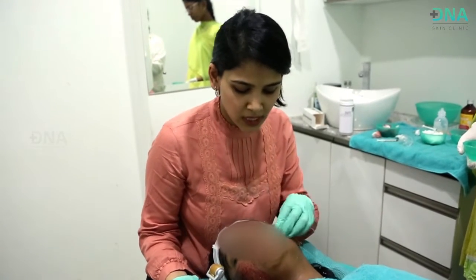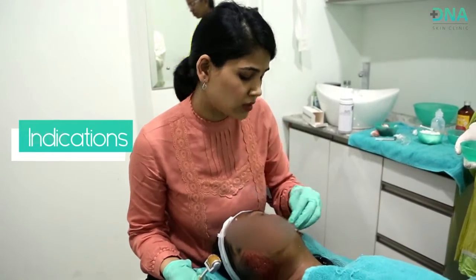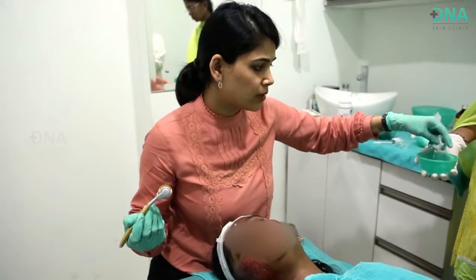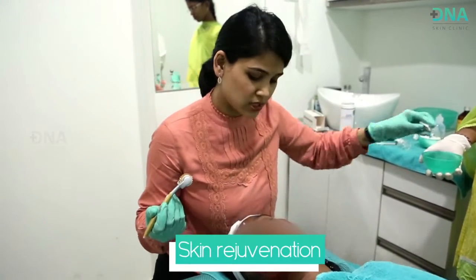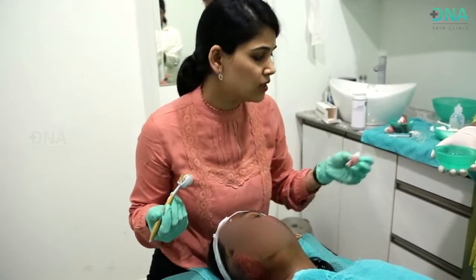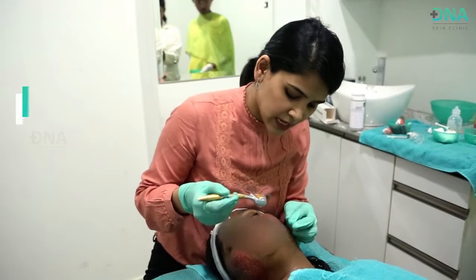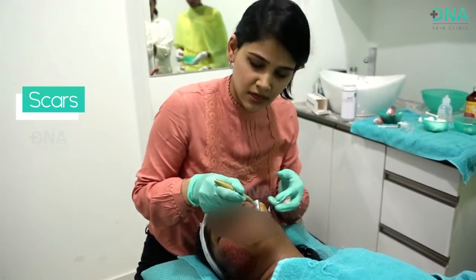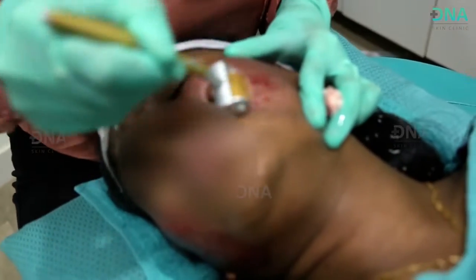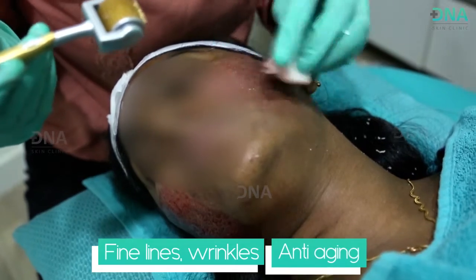Now, what are the indications of Dermarolling? Where all can you use a Dermaroller? Dermarolling can be used as a skin rejuvenating procedure, wherein you don't have to go so deep. It can be a very superficial procedure, and you can stimulate the collagen and elastin fibers. It can be used to treat acne scars. It can also be used in treating fine lines and wrinkles, like an anti-aging procedure.